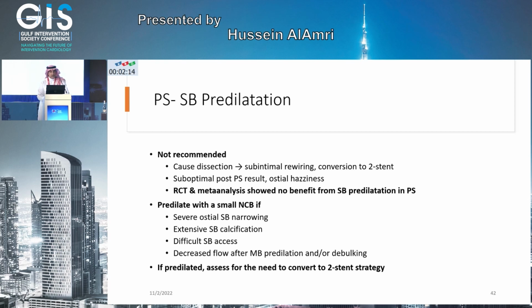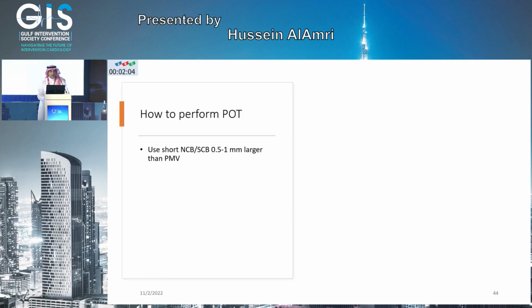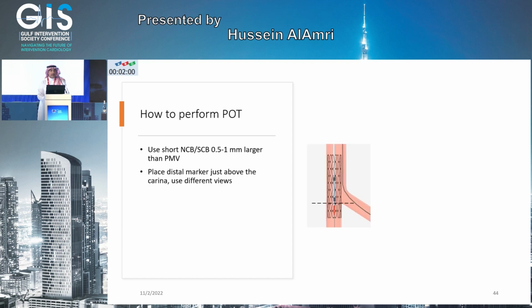In multiple studies, it was shown that there's no benefit except in special cases. In provisional stenting, POT is mandatory. It facilitates further procedures in your PCI, and how to perform it.